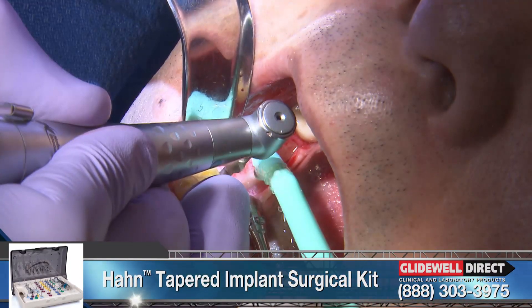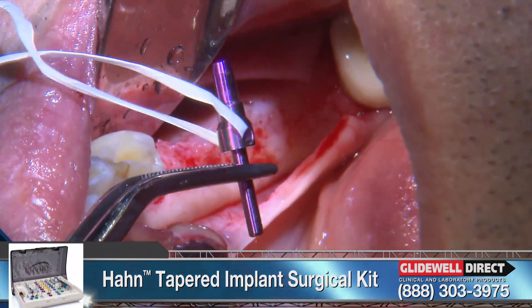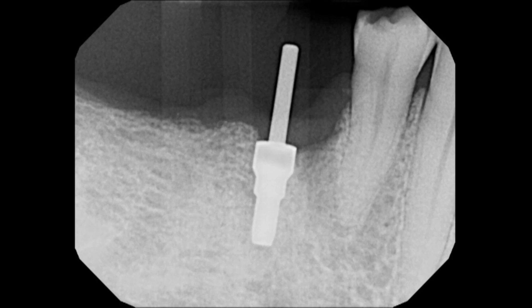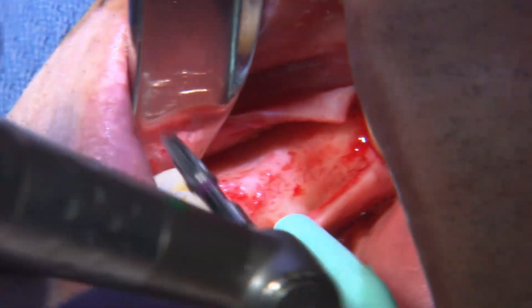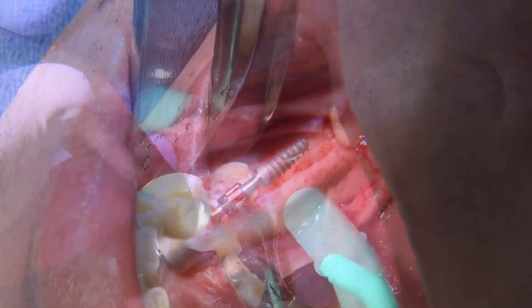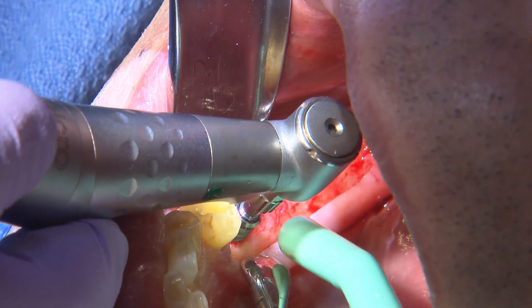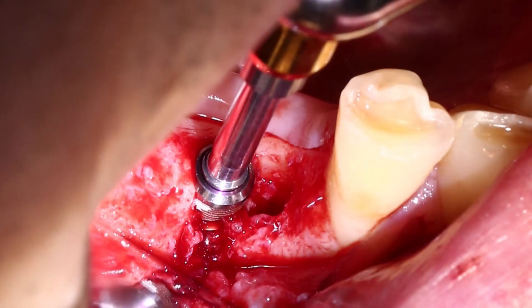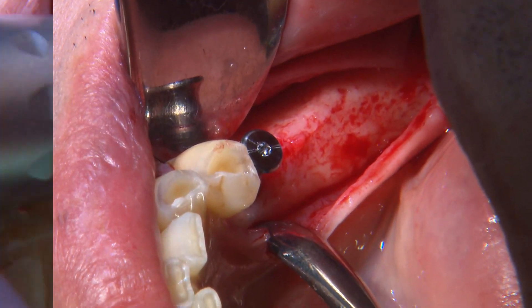I take the patient through the osteotomy drills and create my osteotomies for the procedure. With each drill, I like to check the angulation and make sure that I'm going in the proper direction. I'll place my first implant in the area of tooth number 29 first, and then I can have a measurement based on where that implant is. So I don't create all three of my osteotomies at the same time — I place my first implant, then go back and retake my measurements to make sure I'm far enough away from the next implant. The first implant is in place.